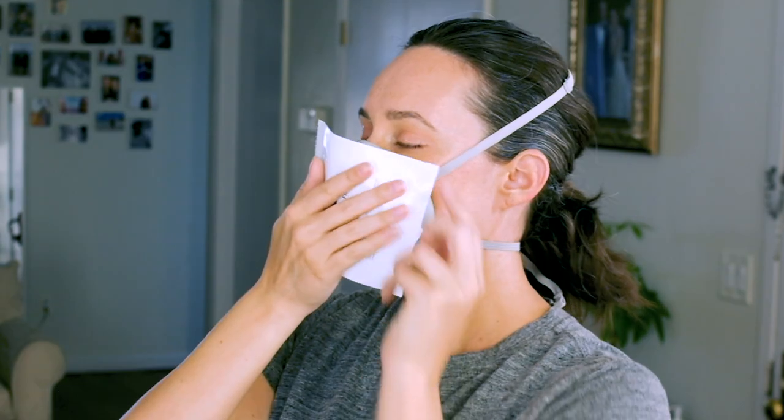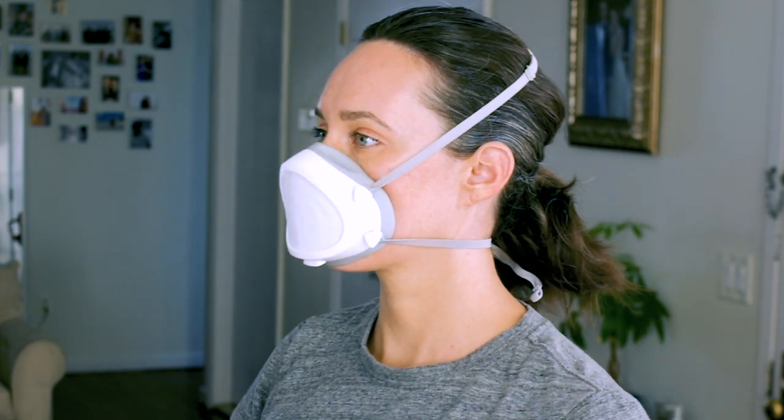Test check the seal by using your hand to cover the front of the mask, or use the plastic bag from the filter to cover the mask, then inhale to check for leaks and adjust as needed.